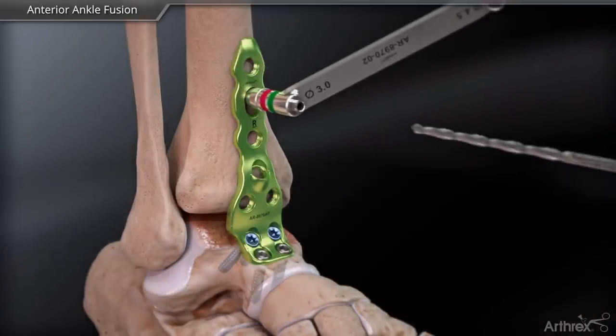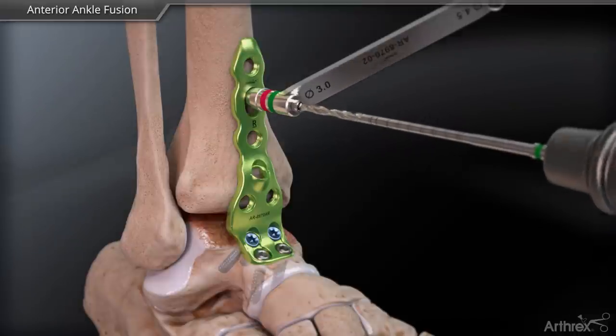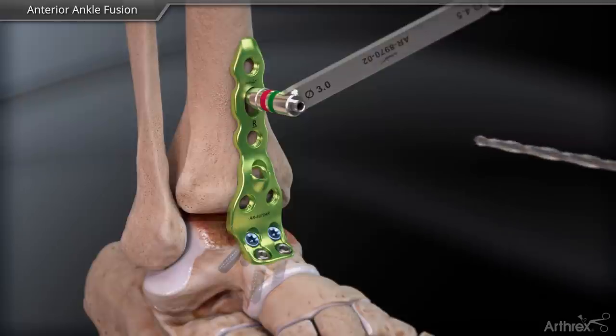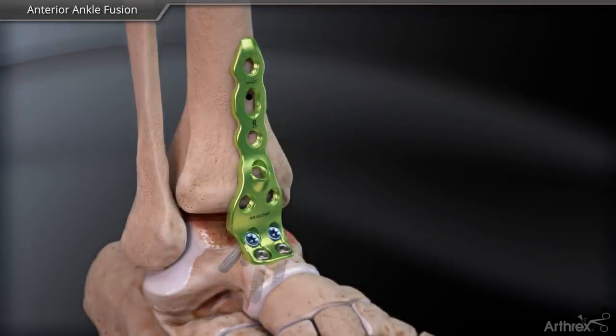Obtain initial compression across the arthrodesis site and secure the tibial portion of the plate to the bone by placing a non-locking screw eccentrically in the oblong compression hole.